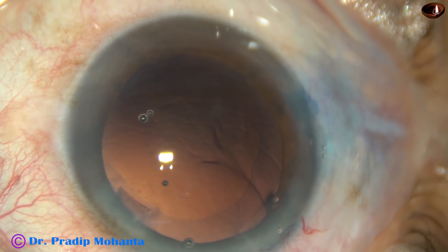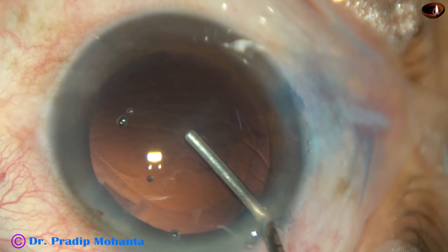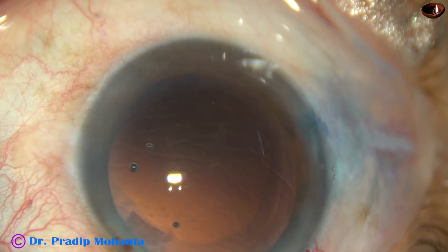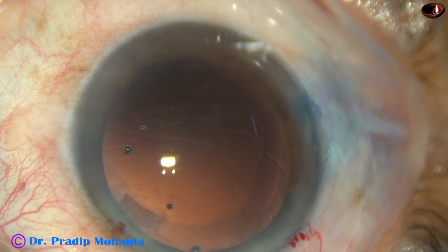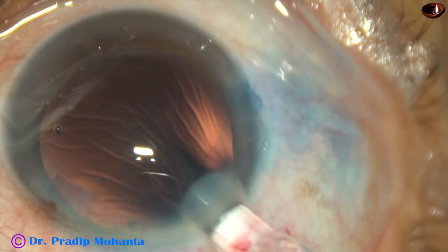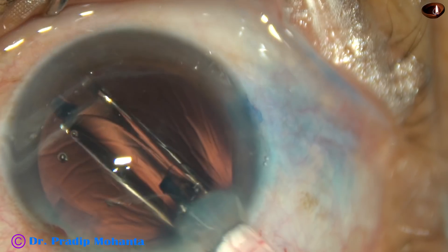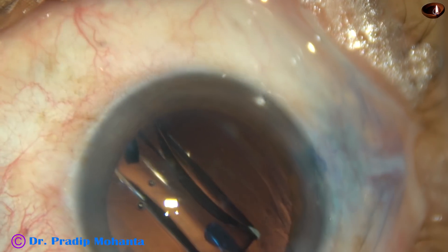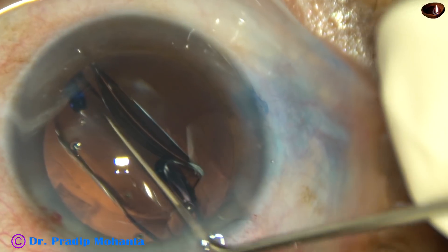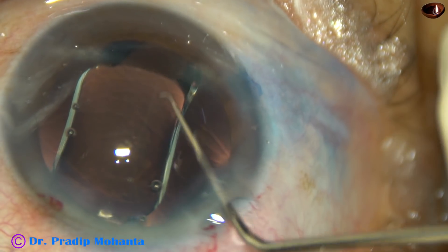And now, in this case, we are going to implant a Hoya intraocular lens from Japan. This is a hydrophobic acrylic monofocal intraocular lens with a beautiful pre-loaded system. Here goes the lens — the leading haptic is going into the capsular bag. And now the trailing haptic. Let us see if it has gone into the capsular bag or not. No — just by a push of the Sinskey hook, the trailing haptic has gone into the capsular bag.